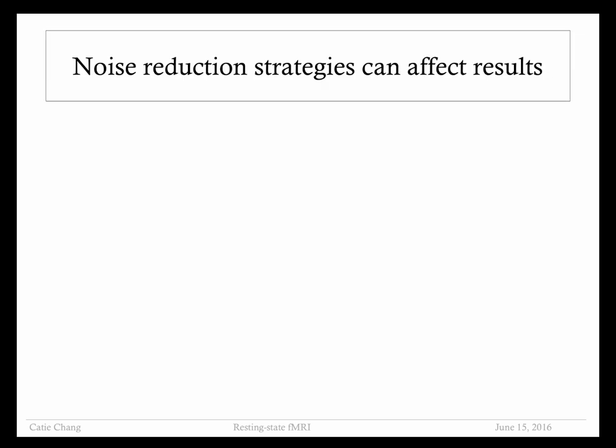Do you know if physiological noise tends to be higher or lower frequency? Oh, yeah. There are a few different types of physiological noise, and some are pretty high frequency. For instance, cardiac pulsation is at about the frequency of the heart rate, so when we're using our normal 1 to 2 second TRs, we're really undersampling that heart rate.